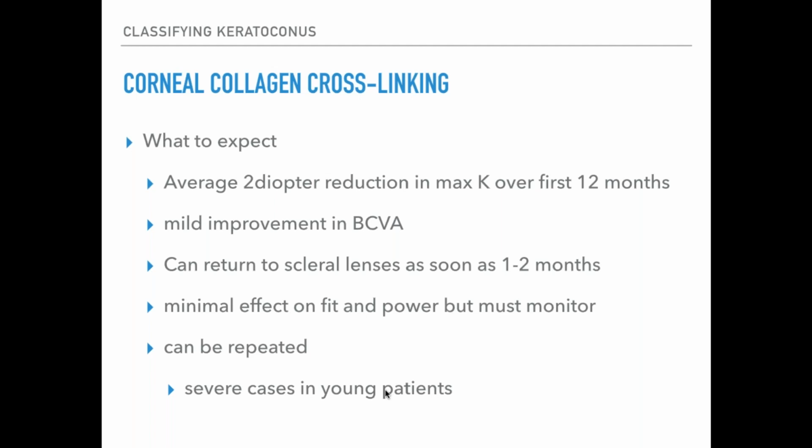Remember, we're not cross-linking the sclera. So the part of the contact that actually rests on the eye won't change. All it's going to change is your clearance and possibly a little bit of your power, just because of the refractive index differences between the contact, the tear film, and the cornea. So don't be afraid to put a scleral lens on before and keep it on as treatment goes.